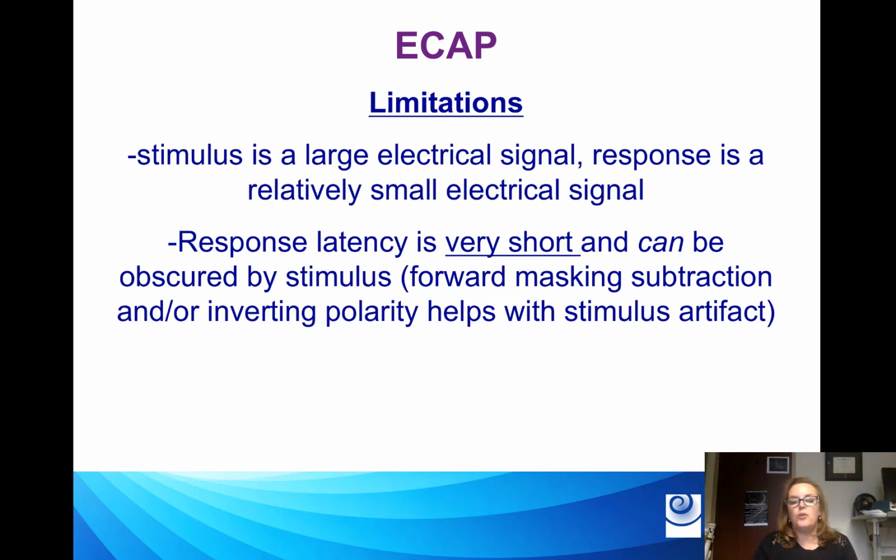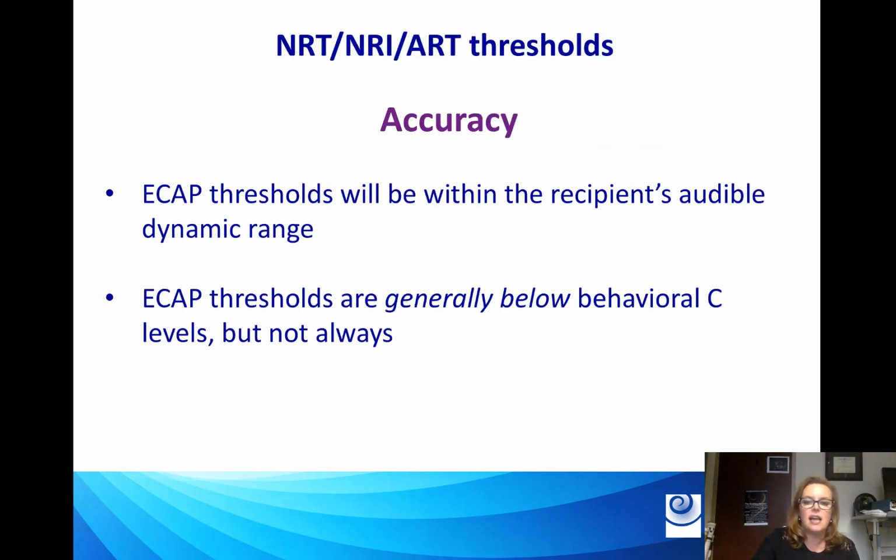And again, there's lots of ways to get around this, and we essentially, and by we I don't mean me, I really had nothing to do with any of this, we as a field have really had nice artifact reduction techniques that really are getting rid of these limitations, and we'll talk about that a little bit more in our live online class. Okay, accuracy.